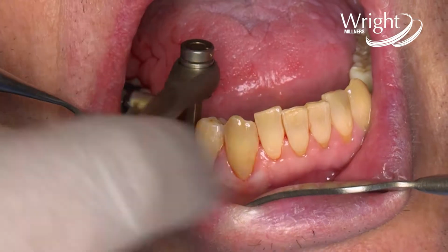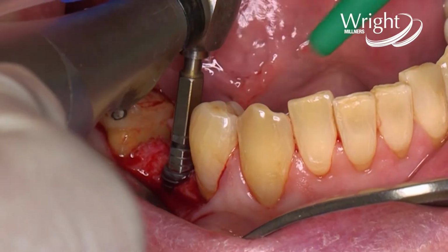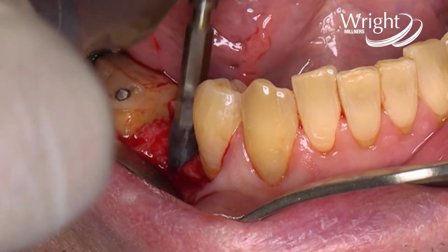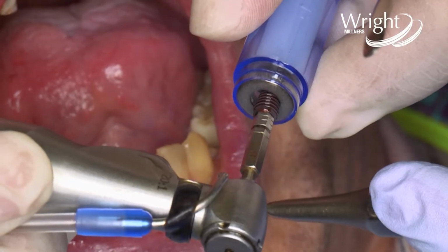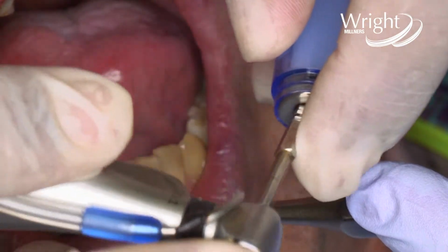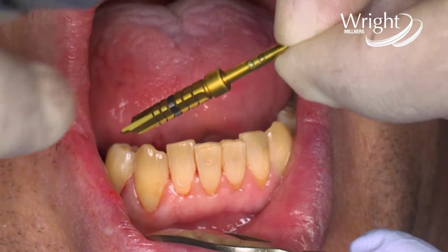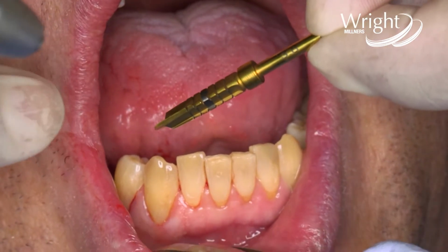I'm going to reverse the implant out completely, and this is all fine to do. Okay, we'll put it back in the carrier, trying not to touch the sides, and remove that. So what I now do is I will go one drill up from the 3.3, which was the core drill, which is the 3.8 drill, as you can see.